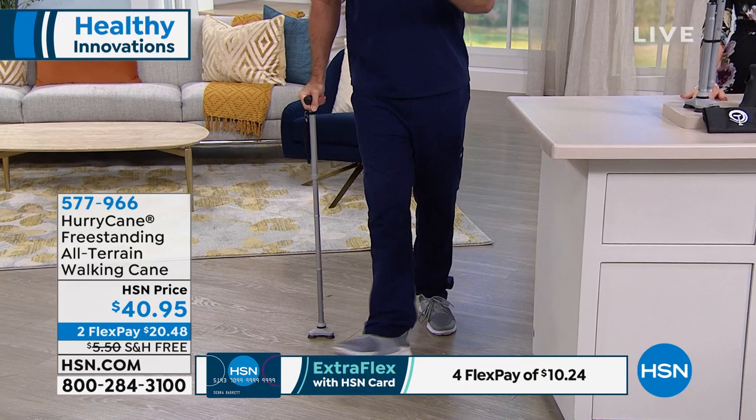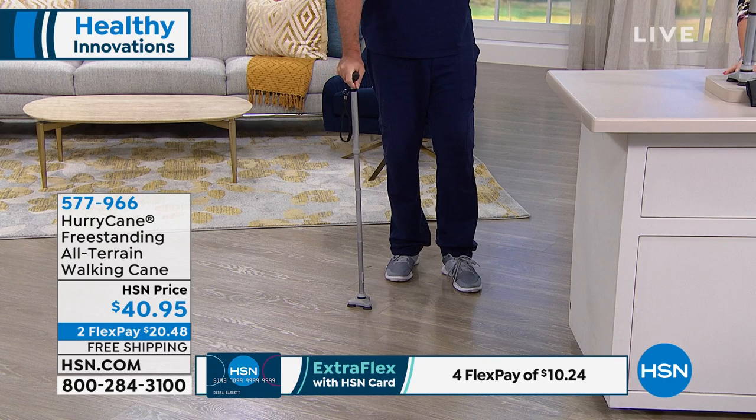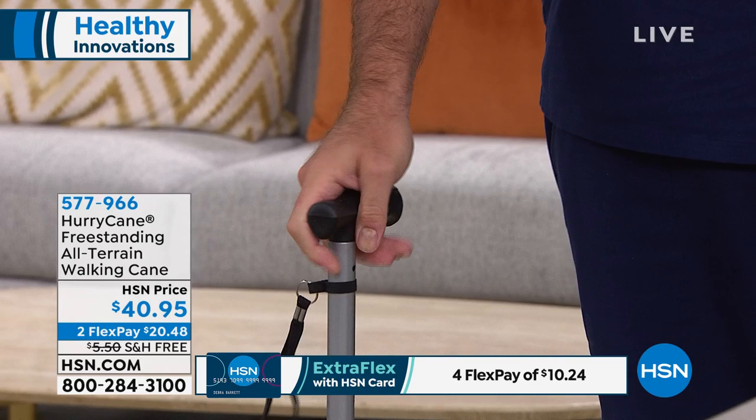It has the pivoting base that can actually rotate 360 degrees, and I can hold on to the handle the whole time. It's got a beautiful, comfortable, ergonomic handle. We're going to give you the extra heavenly handle if you want a larger, cushier handle, if that's more appropriate for you. But look at that handle — it's very easy on the hands. They actually design these handles with a human hand in mind, so when you're walking it's going to become an extension of you.